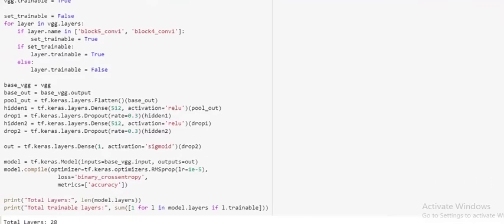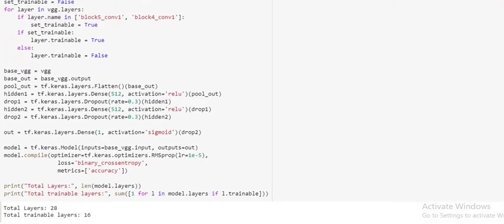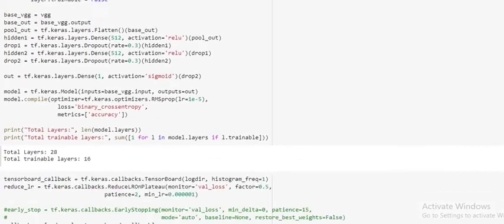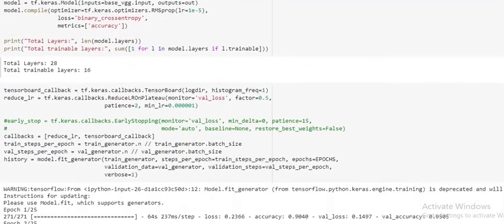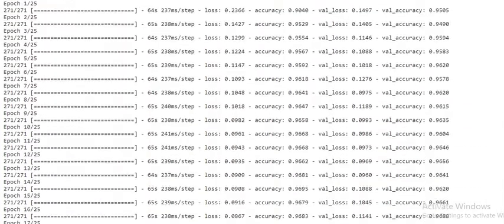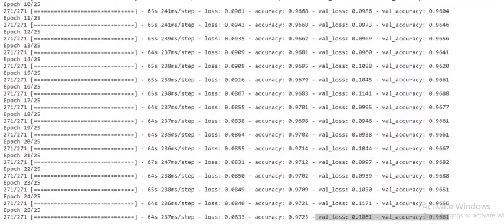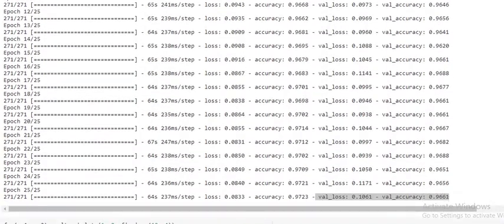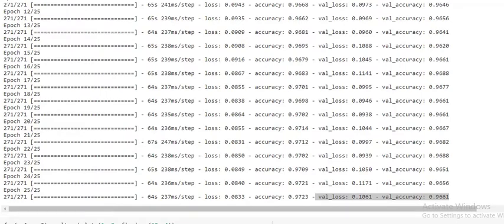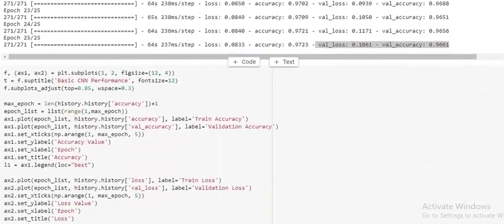We reduced the learning rate here since we don't want to make too large weight updates to the pre-trained layers when fine-tuning. After training the model, we got 96% validation accuracy without overfitting. Here is the plot.